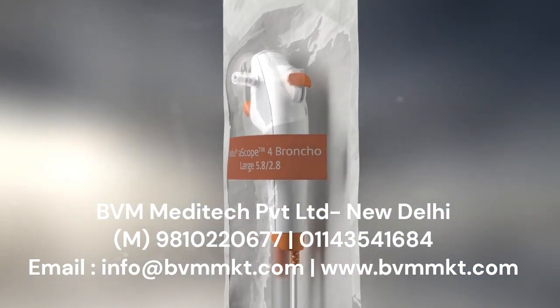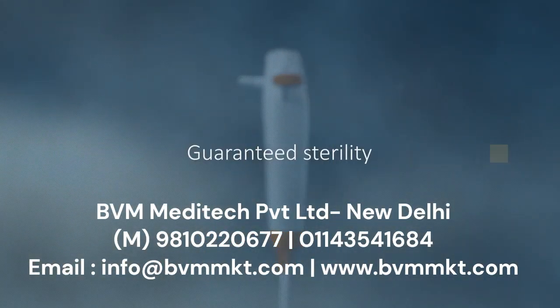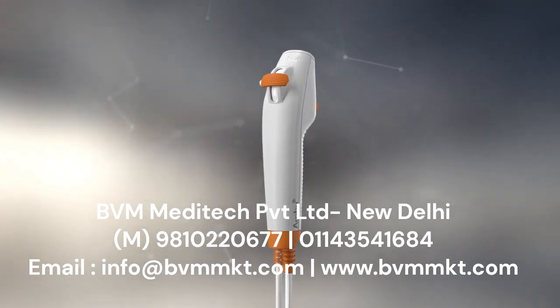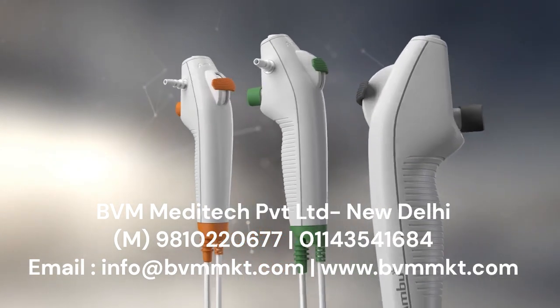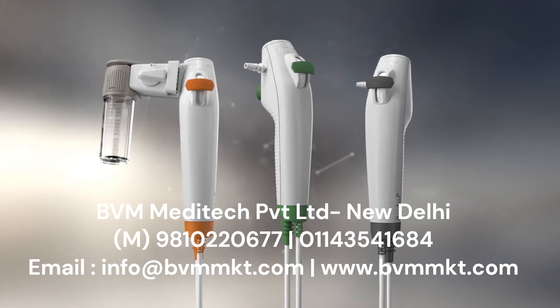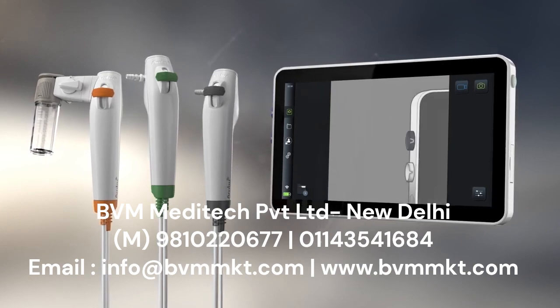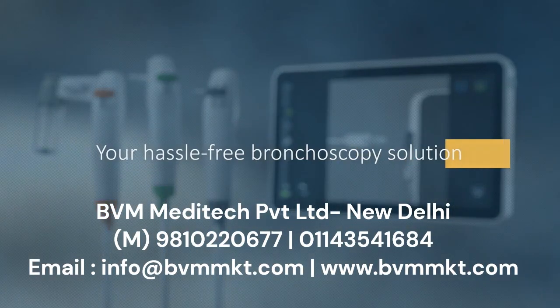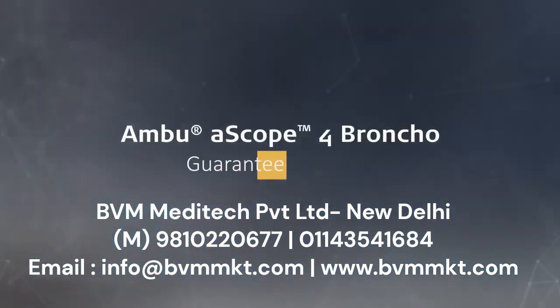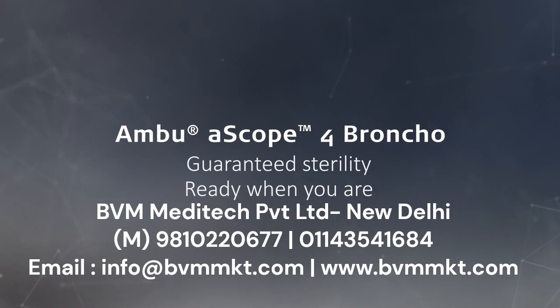With the Ambu aScope 4 Broncho, you get a brand new sterile bronchoscope straight from the pack every time. You get more than just a bronchoscope — it's a fully integrated solution with three scopes, a tailor-made sampling solution, and a high-definition monitor to help you deliver the very best in patient care. Ambu aScope 4 Broncho: guaranteed sterility, ready when you are.